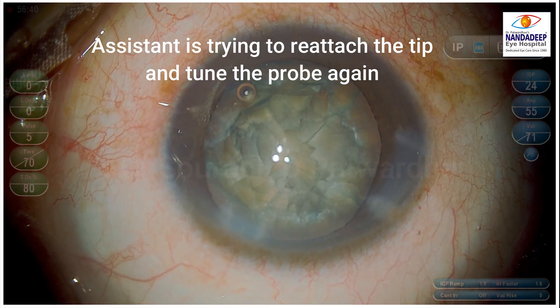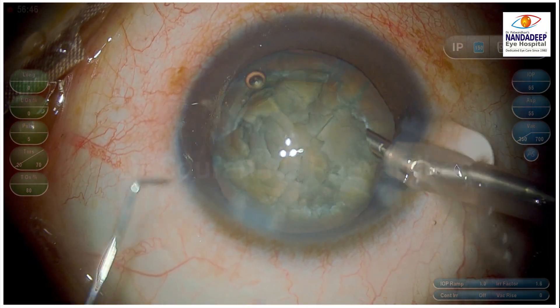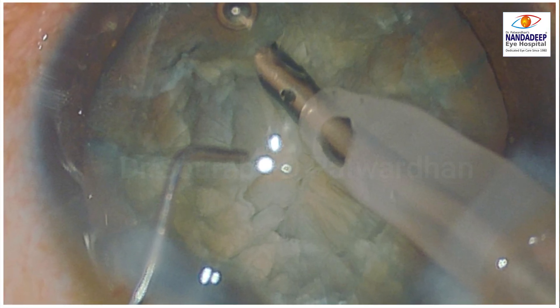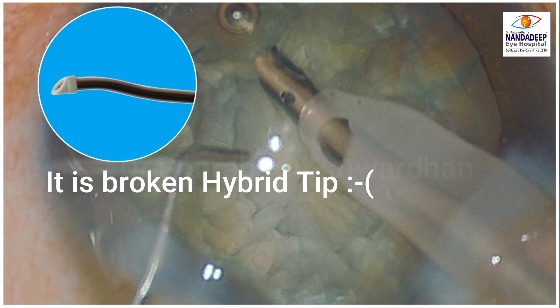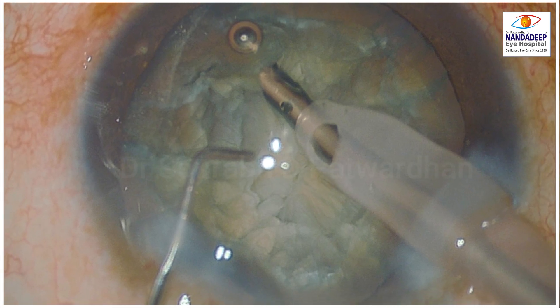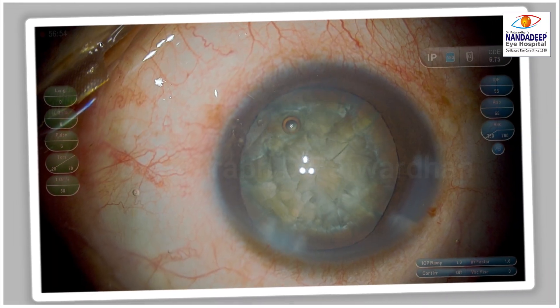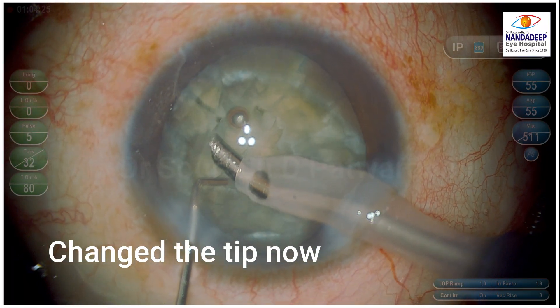When I start the quadrant removal expecting the vacuum should now build up and I should clear the first quadrant easily, I noticed there is a big hole on the tip — which was unexpected. I then realized it's a broken hybrid tip that was placed by mistake in the phaco set. Normally a hybrid tip is covered by acrylic or plastic which covers this hole, but since that part is broken, there is a big hole, and because of it the vacuum cannot build up — all the aspiration is going through that hole even with a piece in front of the phaco tip.